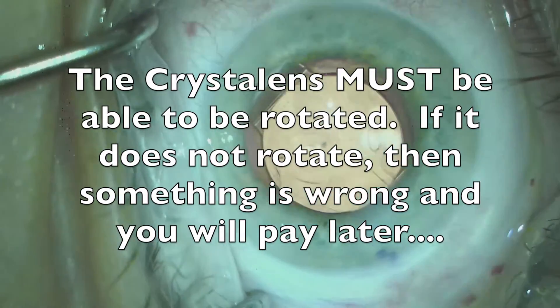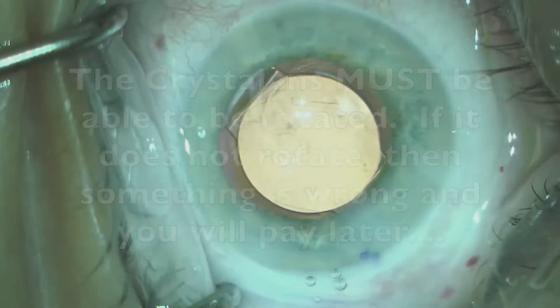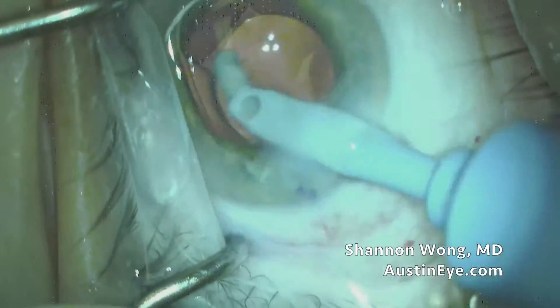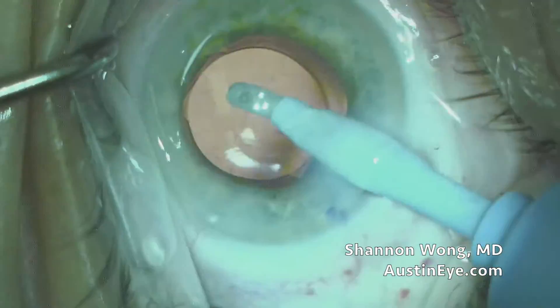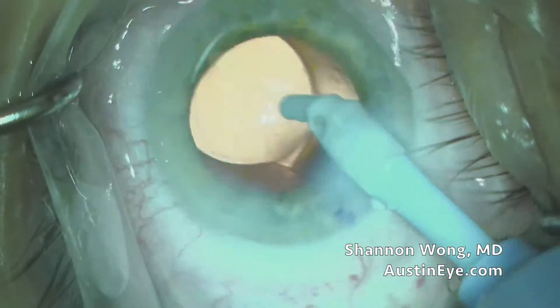A key concept is, if you can't rotate this lens, something's wrong — it has to rotate. And if it can't rotate, then there is some type of structural explanation for that.